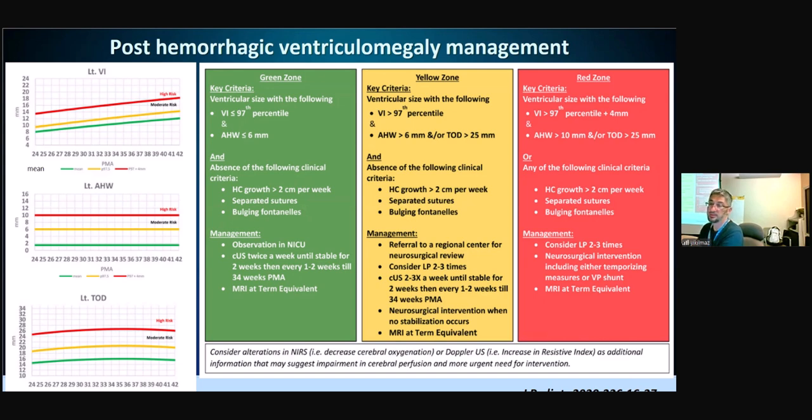And you make the measurements basically. So when I report a follow-up study, I usually look at the first study. Okay, there is intraventricular hemorrhage, dilatation. I just do the measurements. I try to make the measurements accurate. That's what matters. I usually remeasure. And a few millimeter differences does not affect much.